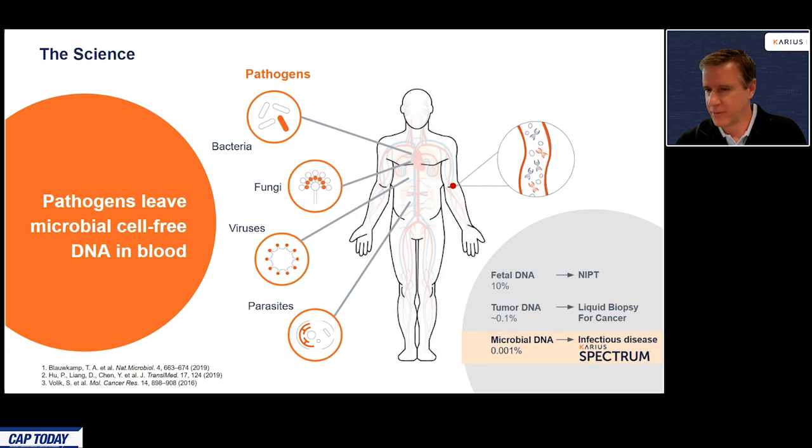And so for those of you familiar with other cell-free DNA-based diagnostics, particularly human cell-free DNA-based diagnostics like those used for non-invasive prenatal testing or used for solid organ transplant rejection monitoring, and certainly those used for tumor profiling from plasma or minimal residual disease monitoring in the cancer space, the easiest way to think about the approach that Karius developed is as a liquid biopsy for infectious disease.